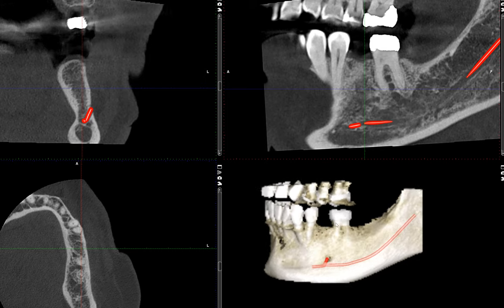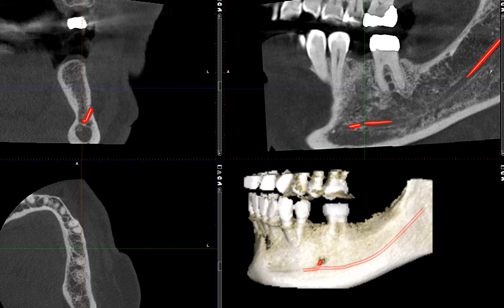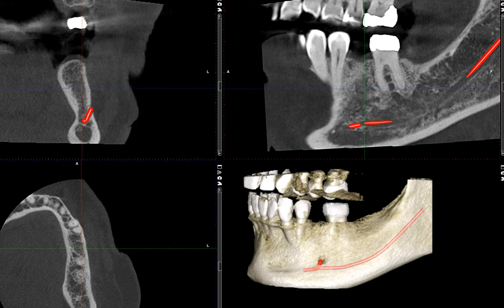Right from this 3D rendering, it should be clear that there is a mental foramen. Not only have I traced the mental foramen and the nerve that's exiting through the mental foramen, I traced part of the incisive nerve as well. So it would be of vital importance not to injure this area when you're placing an implant.